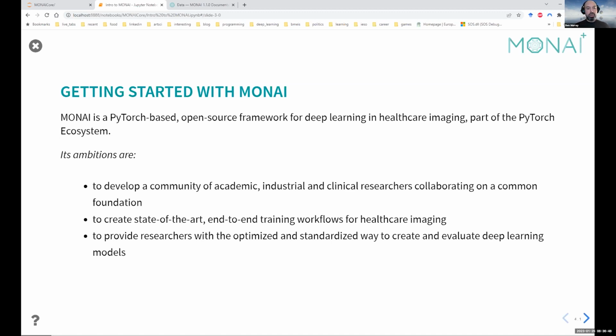And that means facilities for training in challenging environments, such as when you have large amounts of volumetric data, and also providing networks that reflect the state of the art in terms of benchmark beating, and the architectures that people care about at the moment, as well as the workhorse architectures, which are very important because clinical adoption requires a little bit more proven time under a particular architecture.